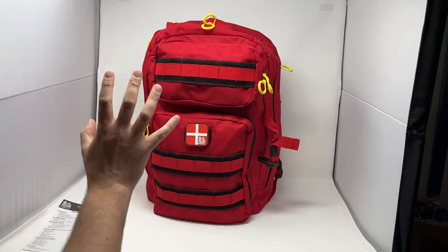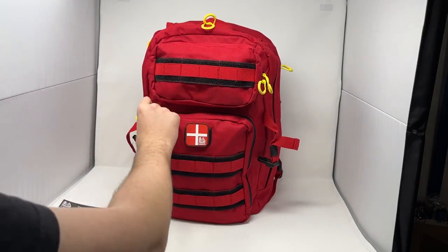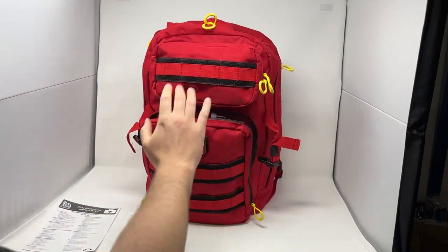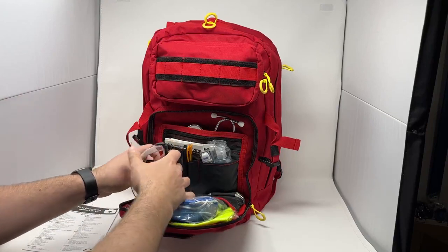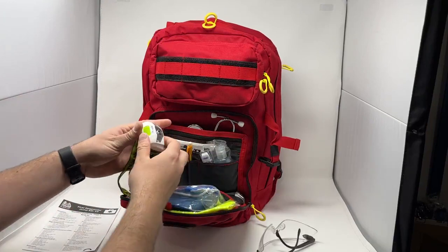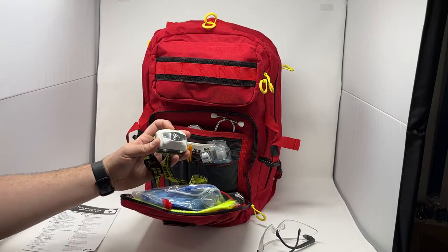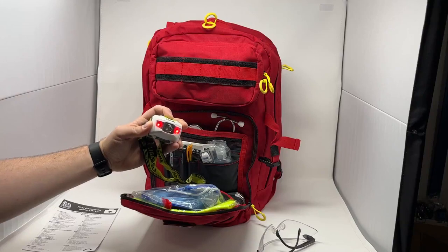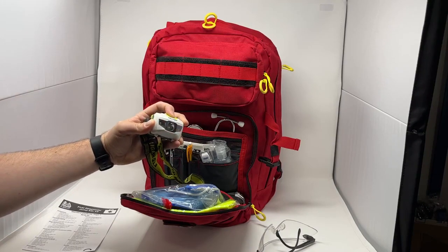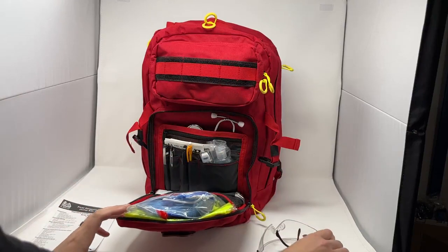Everything is organized to make access and finding things nice and easy. This big pouch up the front has your assessment gear, stationary gear, and personal protective gear. We've got some safety glasses for eye protection. We have a full headlamp here that's one-size-fits-all. It comes with your low beam, high beam, red light, and flashing red — just an amazing piece of gear for responding to night calls or calls in the dark.